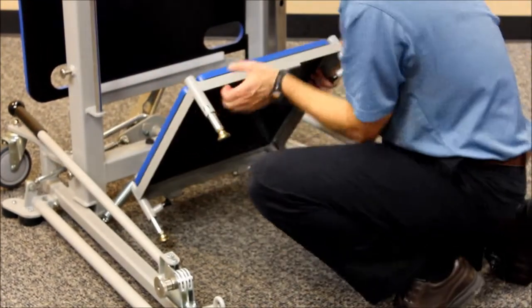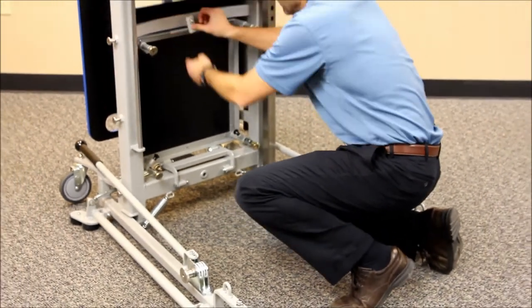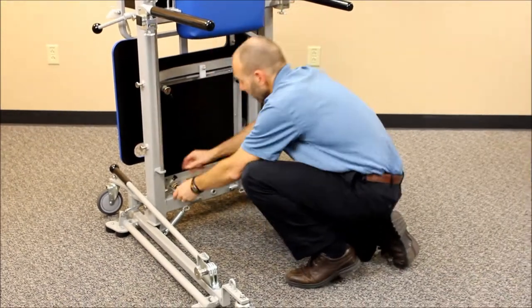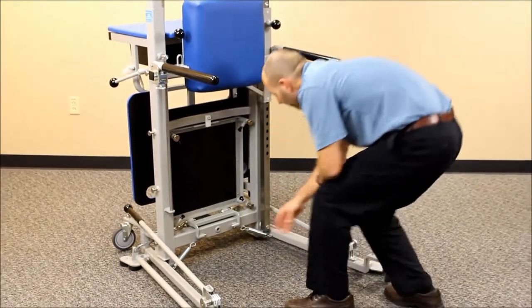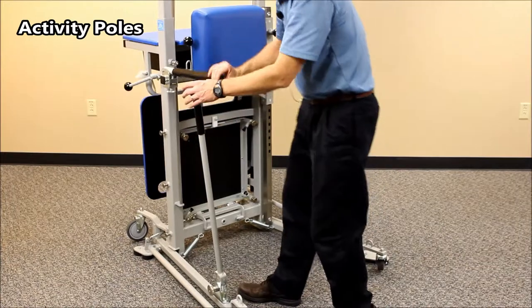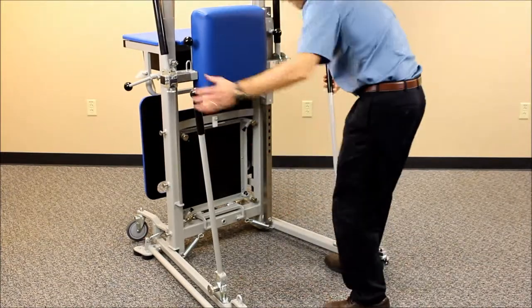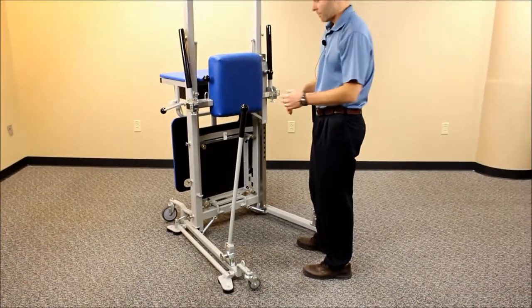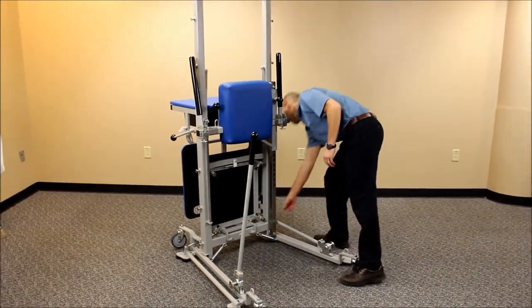To put the step back up it's just the same process in reverse. When you store it, you want to have it all the way in so it doesn't restrict movement of the other accessories and features. On the side here, lowered into position, are what we call activity poles. The activity poles can be used for a number of upper extremity activities in both sitting and standing positions, which will be covered in future videos. For now, we'll store those down out of the way into a low position.